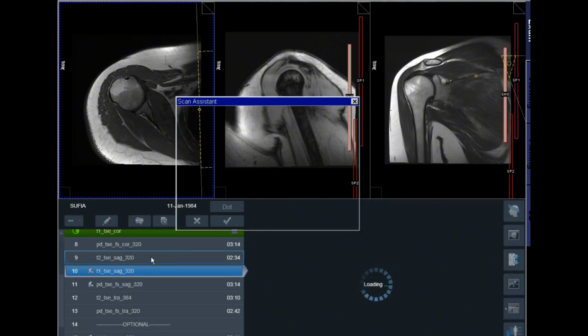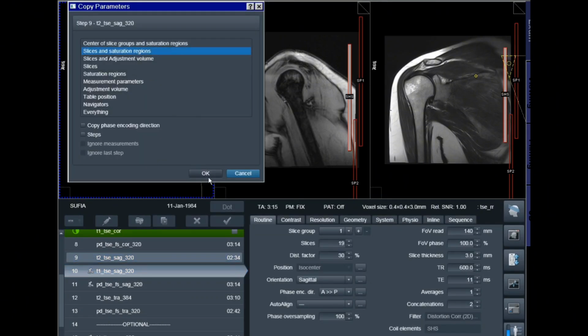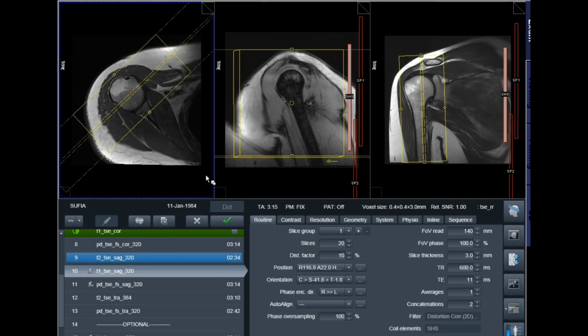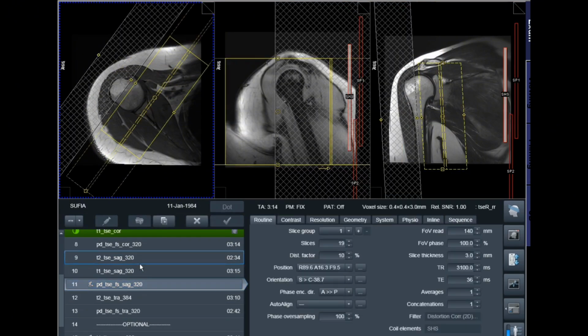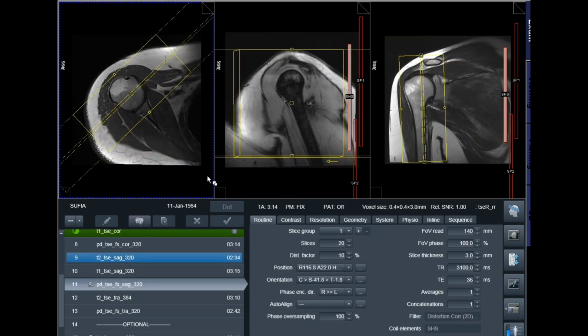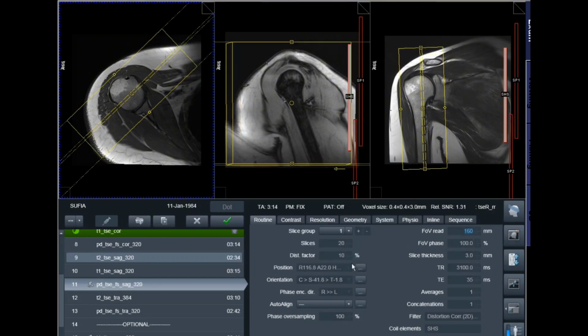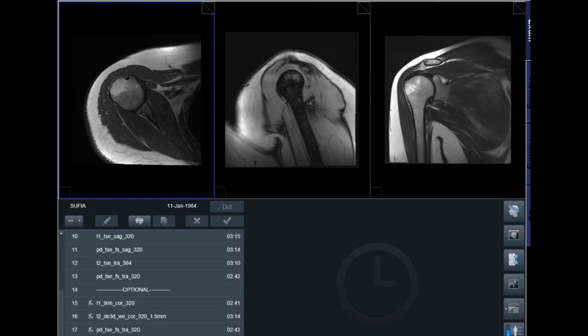Interpretation of MRI report. Key components: osseous alignment, rotator cuff integrity, tendon signal and thickness, labral status, bursa and effusion, AC joint changes. Final impression. Impression guides clinical decision-making. MRI findings and clinical correlation. MRI findings must always be correlated with clinical symptoms, physical examination, functional limitation. Imaging abnormality alone does not mandate surgery.